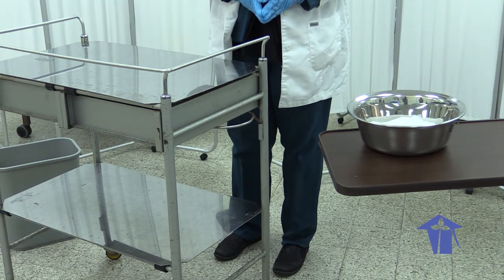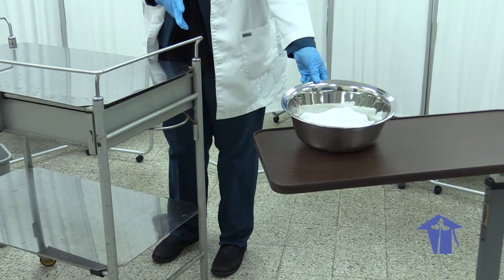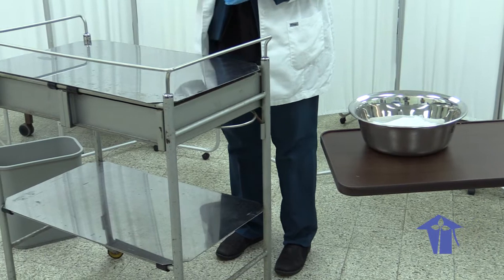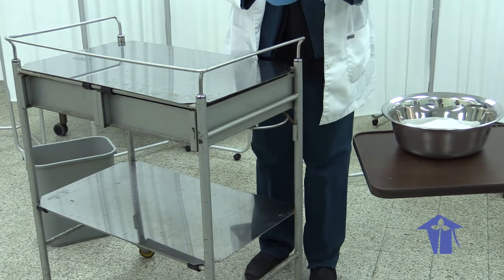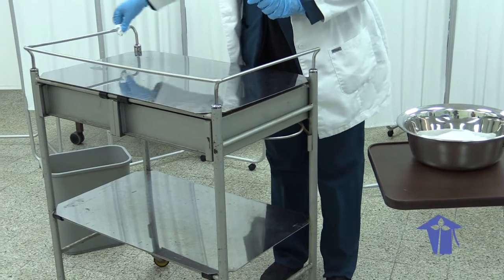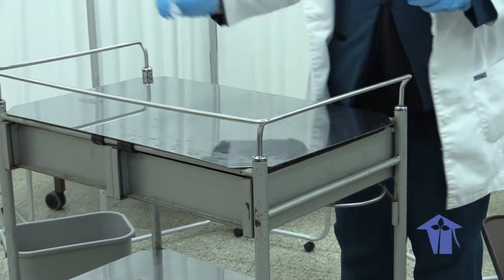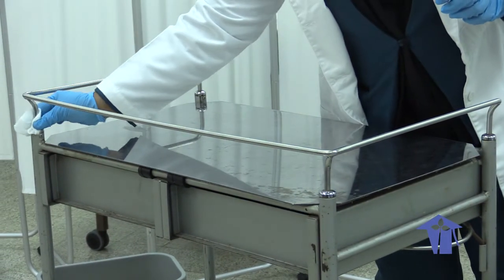Equipment needed for cleaning your trolley will be an alcohol-based solution, a basin, gauze squares or cotton, whichever is available to you, your trolley, and a bin. Your first step is to clean the point furthest away from you and the topmost part of the trolley. Remember, during this procedure, we are using the one wipe and throw method.